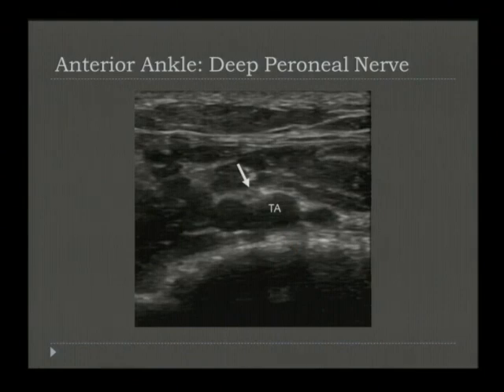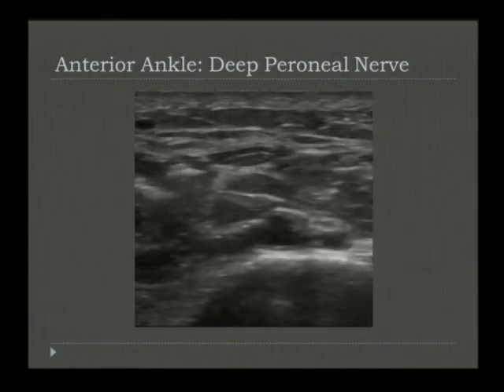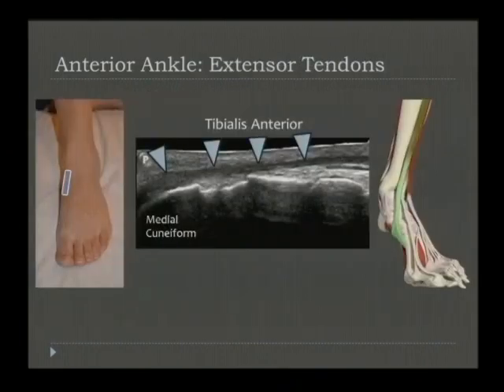artery. As it descends, it will cross over the artery, so as we go a little bit lower and near the level of the actual joint, you can see that now it is sort of centrally located in respect to the tibial artery, and as we go more distally, you can see it finally lies along the lateral aspect. Important to identify this structure. People with anterior impingement can actually get neuromas and fibrosis surrounding these nerves and pain to this region. I have often injected this particular nerve in several of our football players because of anterior impingement with surrounding fibrosis.